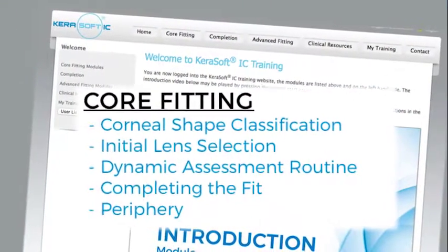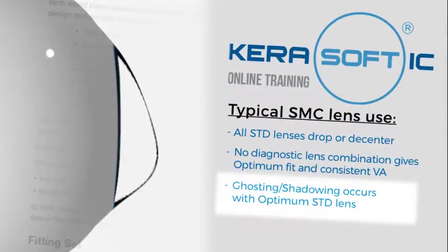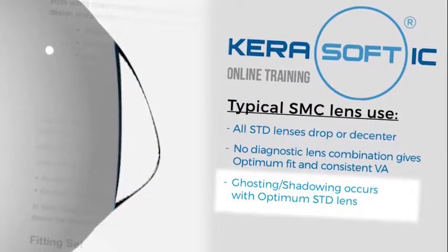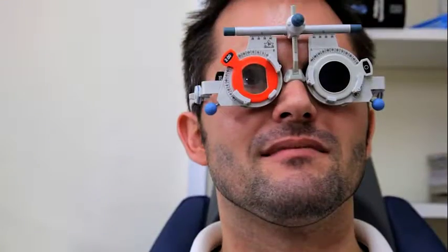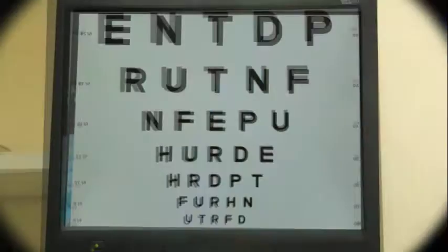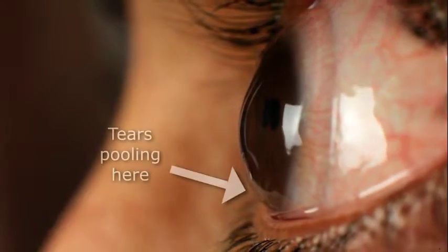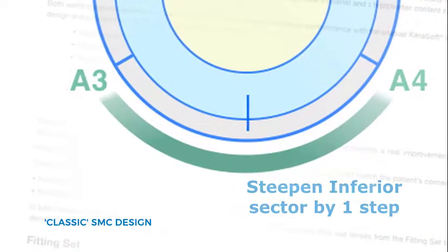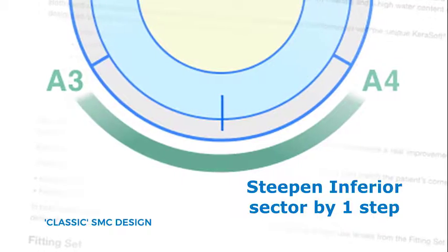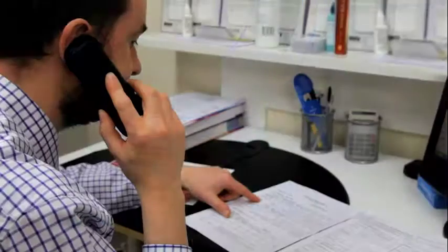In the third scenario, where there is significant inferior corneal curvature, the optimal standard periphery diagnostic lens still results in visual acuity that displays marked ghosting and shadowing. This is a result of tears pooling in the inferior sector. Tightening the lens only in the inferior sector by 1 step will often resolve this issue, as it ensures a more uniform tear layer under the lens.